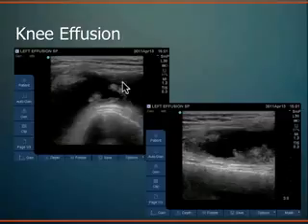This is an example, a patient I saw a couple weeks ago, with a joint effusion, just a classic presentation of knee arthritis, acute exacerbation, lots of pain, lots of swelling in the knee. This is that suprapatellar pouch of the joint space. The knee joint space extends pretty far above the knee in that suprapatellar pouch, and when you have a joint effusion, that area can be extended or distended. And this is the fluid collection in there, all fluid with some joint debris floating around. This is just a chronic, classic osteoarthritis presentation, seen quite well.